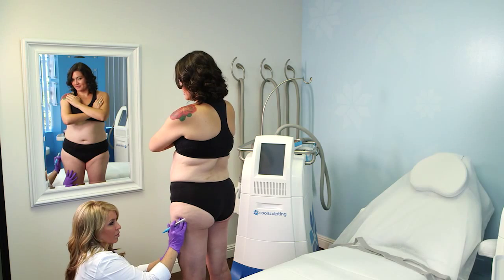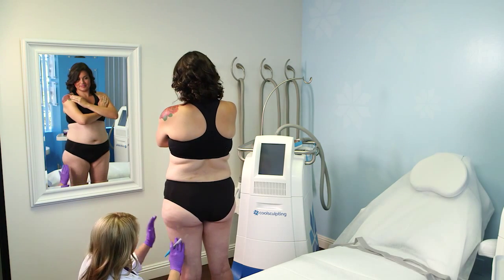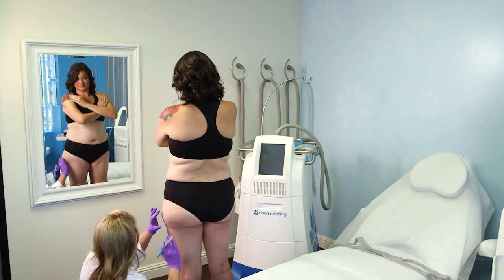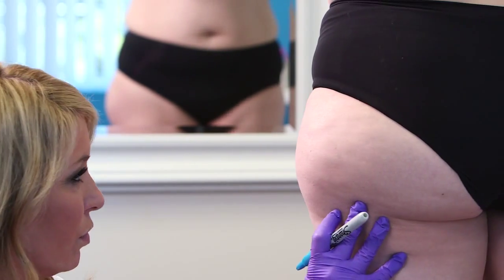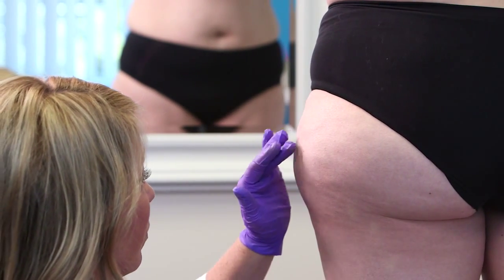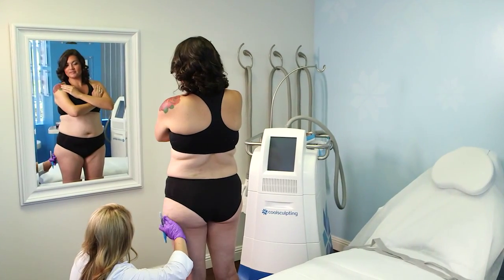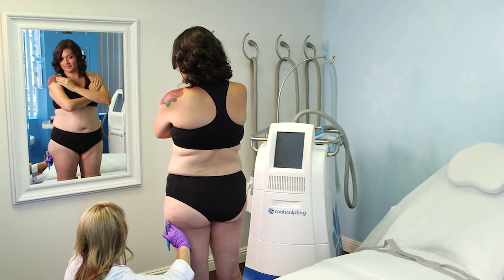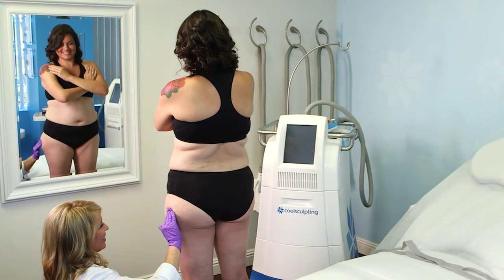Assess the outer thigh while the patient is standing with their weight evenly distributed. Sit at eye level to the treatment area and assess the patient from all angles. Visually determine if the patient has a peak and pronounced pocket of fat on the outer thigh. Asymmetry is common in the outer thigh — discuss differences in fat distribution with the patient as it will affect the marking and placement of the applicator.